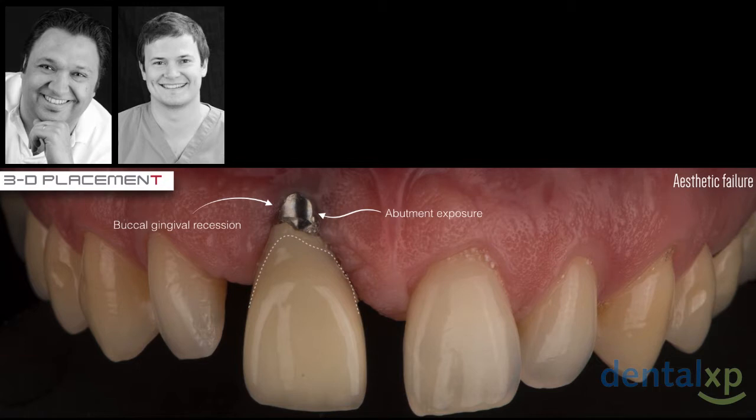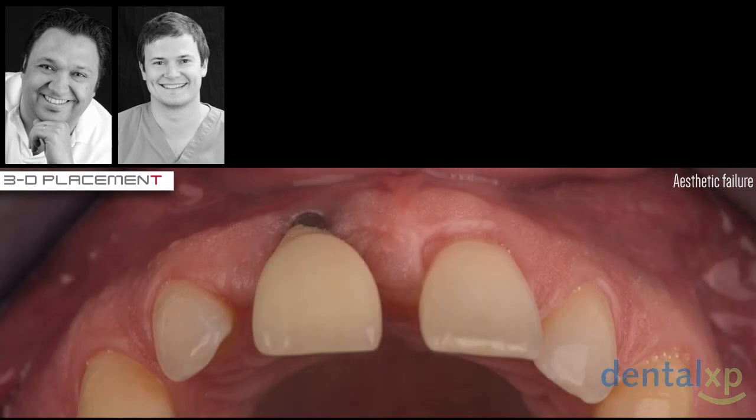Just like in a case like that, where you can see that in the initial situation you had everything to make it a success: you had soft tissue, you had bone, and just because an implant is positioned too far buccal, the situation will be transformed into a real nightmare, because very often if you want to solve this kind of case, you have to remove the implant. That's the only way, and that's a real nightmare for you, a real nightmare for the referrer, and a real nightmare for the patient.